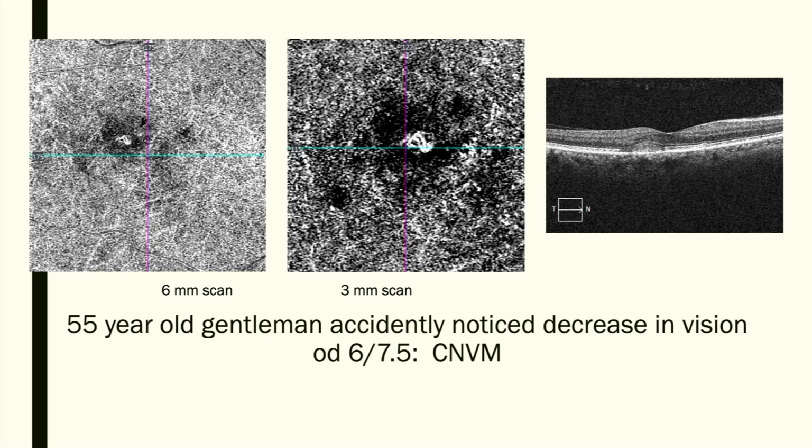And for neovascular AMD, you should definitely do a 3 millimeter scan. My protocol is that for DME patients, I do a 6 millimeter because I want to know as much as possible of what is happening around. For my AMD patients, I do a 3 millimeter.